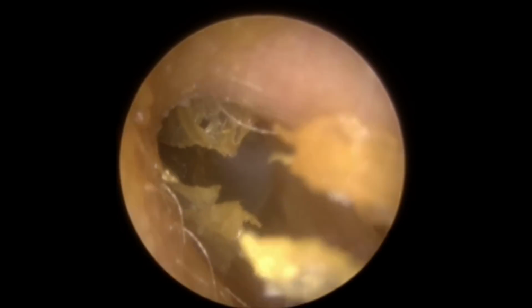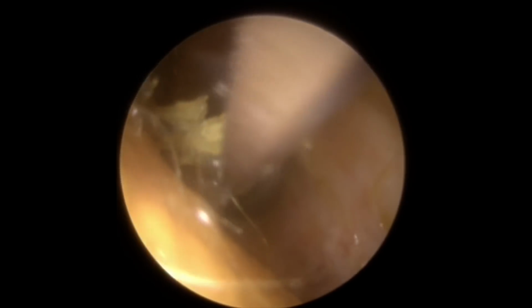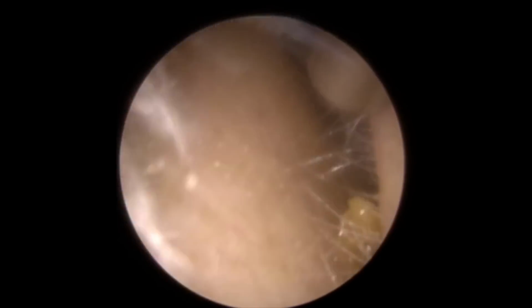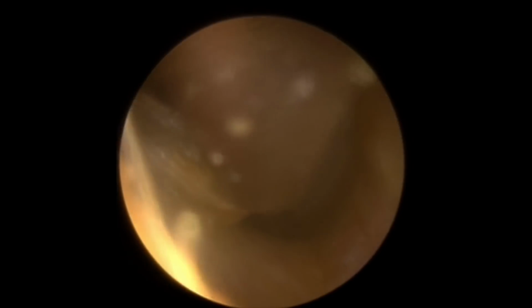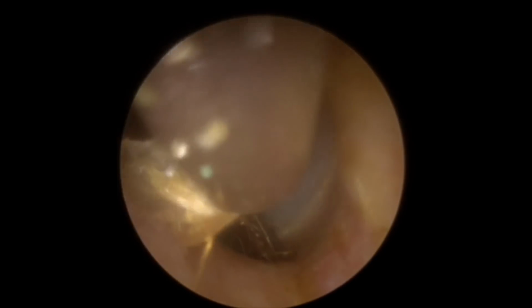Obviously, when it gets to the end where the skin is starting to attach to the canal wall again, you don't really want to pull too hard on that skin. It's just going to cause a tear, which will probably start to bleed. So we're just going to take the worst bits away, just to give us a bit of an angle to get into this last piece of wax. You can see it. It's really frustrating when you get these kind of little flaps of skin that appear. But we're just starting to get a grip.